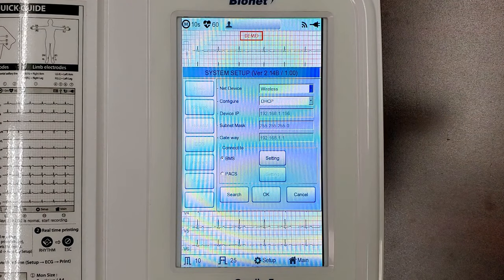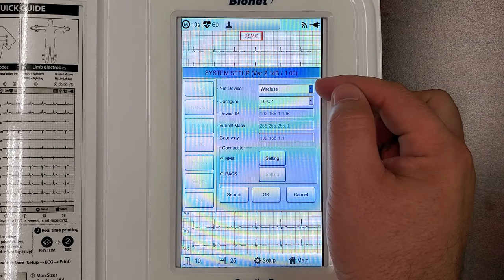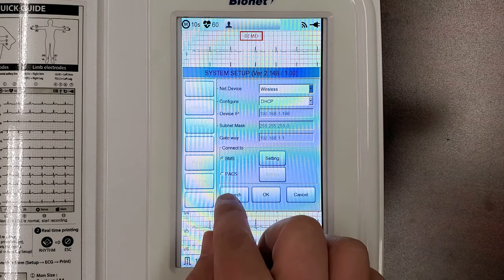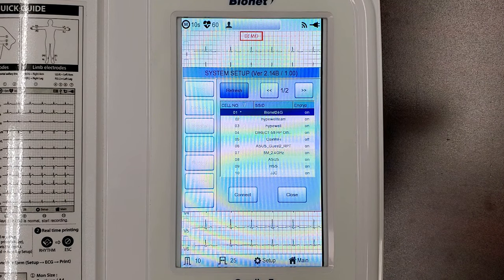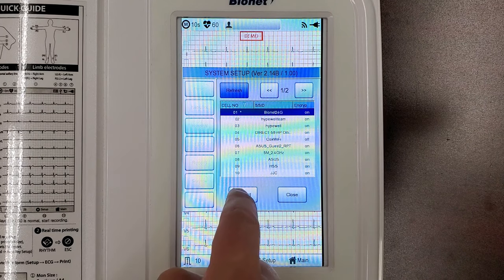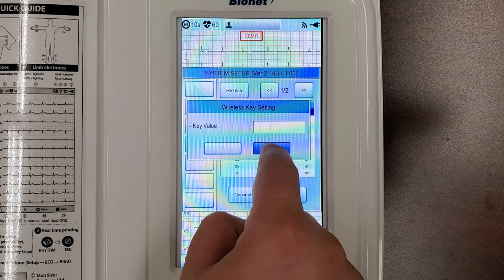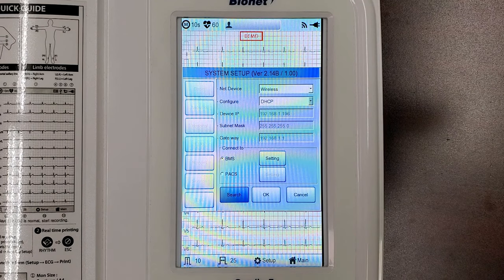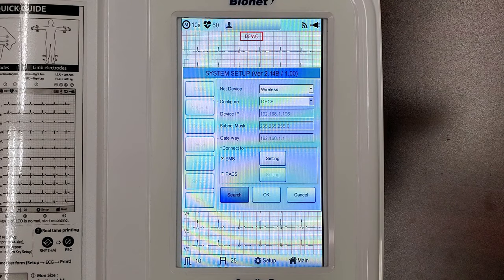Tap the symbol at the top of your Cardio 7's ECG screen. This will open the network screen, and you should select Wireless from the Net Device field. Ensure that Configure is set to DHCP, and press Search at the bottom of the window. Your device will search for wireless networks, or access points, within range. Choose your wireless network from the list and select Connect. The machine will now ask for the password for the network. Once this is input, press OK, and your machine will connect to the network. You should see a success message, which will allow you to hit Close and confirm your machine's connection to the network.